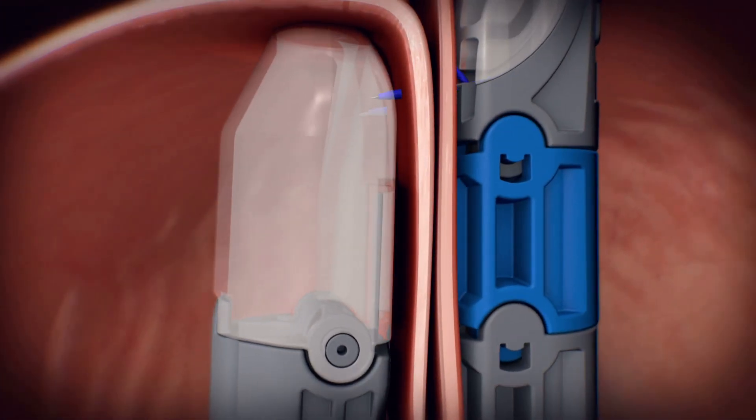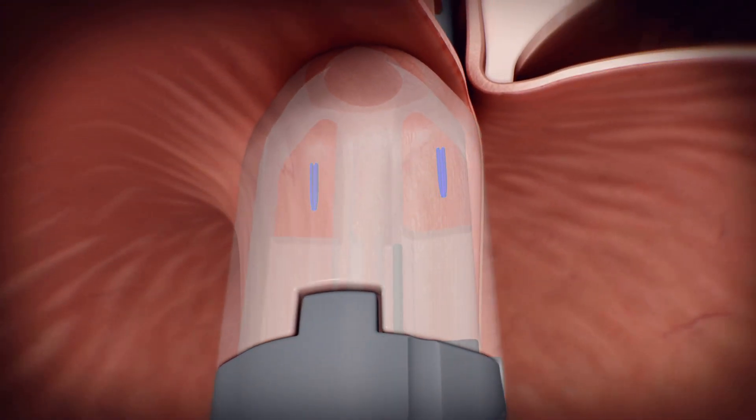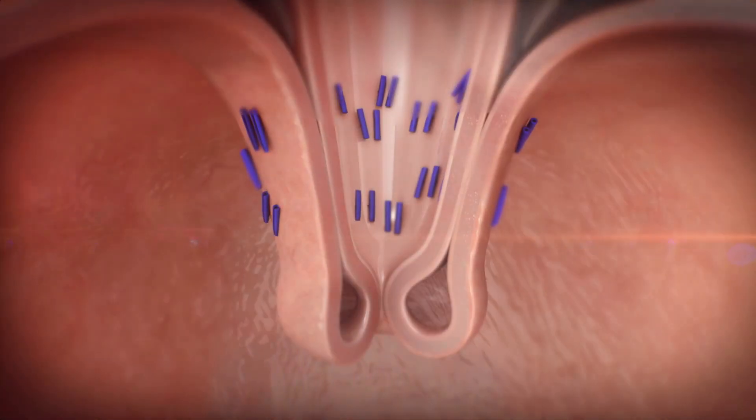The trigger handle deploys a pair of non-absorbable polypropylene H fasteners above the GEJ to oppose the fundus to the esophagus. This retract, wrap, oppose process is repeated in specific locations to ultimately create an omega-shaped valve.